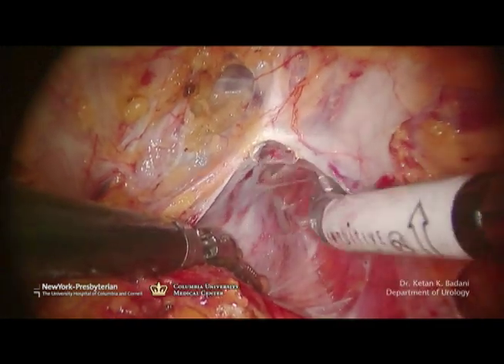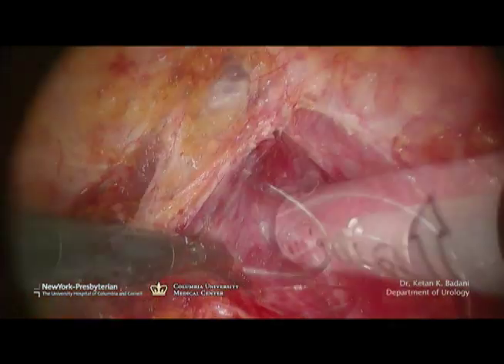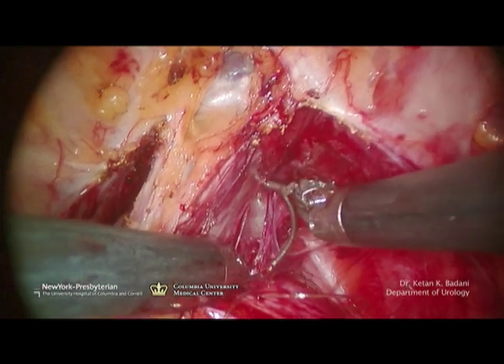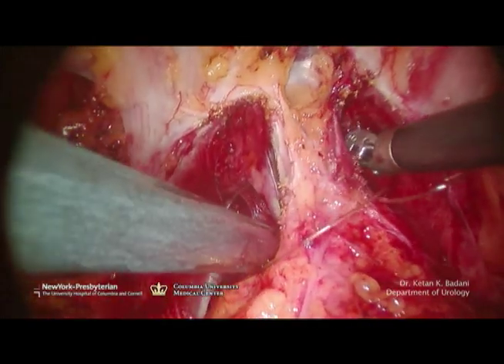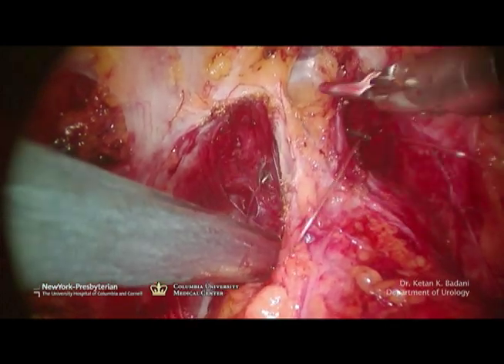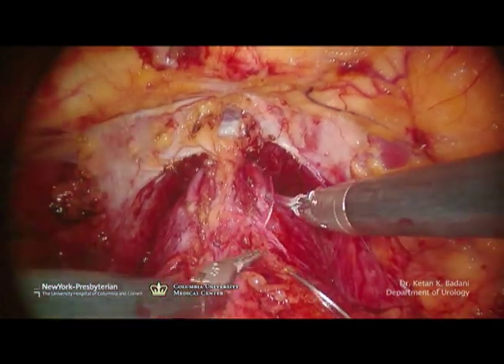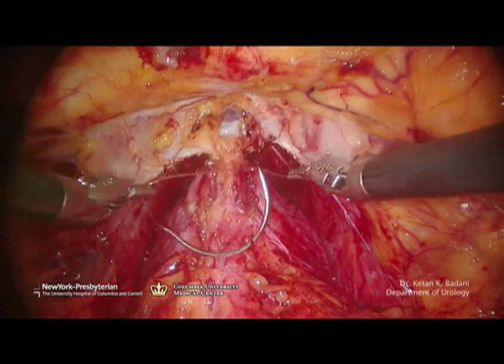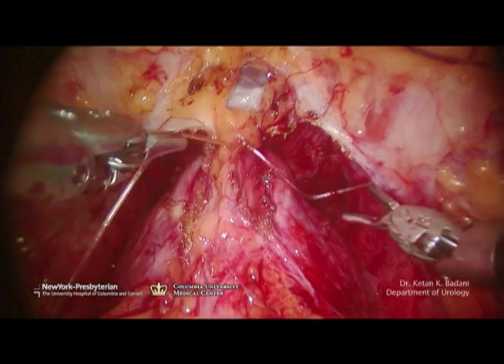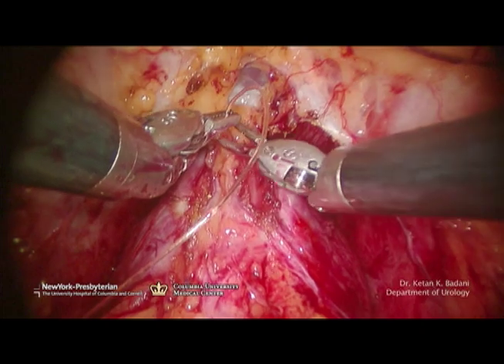Especially near the base of the prostate, up high near the apex, the tissue is a little bit firmer, and sometimes gentle cautery is necessary to divide this. Here I make a pass a little bit more distal than the first pass and bring it out through to the other side, around the same exit point as my previous stitch. I cinch it down just enough to get the knot down, then throw the second one with my right hand. Because this is a Capricin stitch, or a non-braided stitch, I can slide the knot down as demonstrated here.